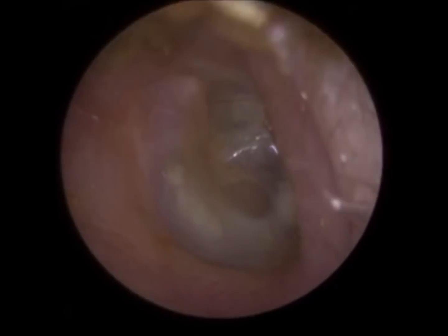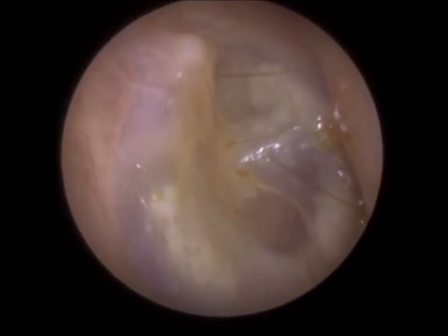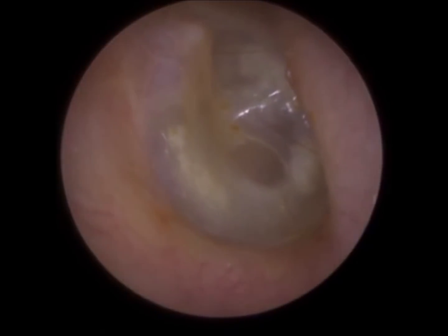And remember, we're really delicate when we're working this close in the ear canal. There's a tympanic membrane. You can see there's a bit of scar tissue, a bit of white scarring around the edge and the periphery. So that's what we call tympanosclerosis.